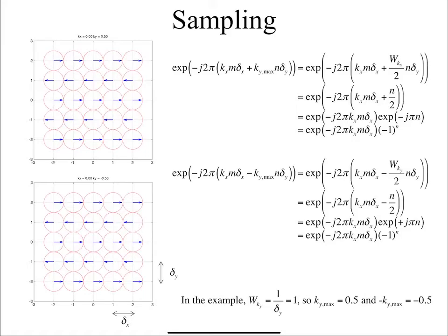Okay? So if you wonder why they were able to skip that line of K-space, that's the reason why. These are things that, if you don't know about them, might actually confuse you if you go into MR. All right. So any questions before we move on?